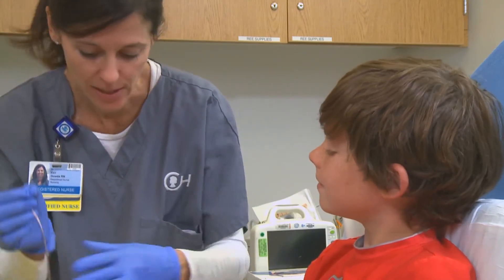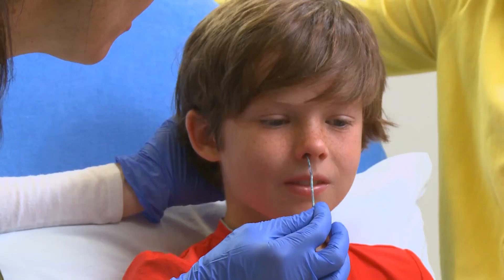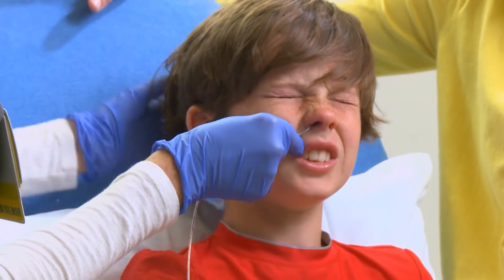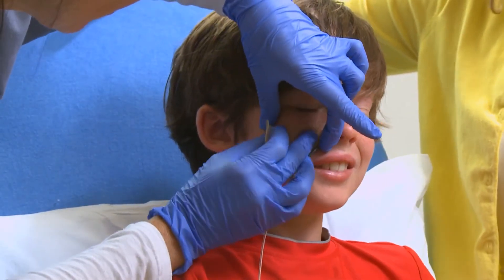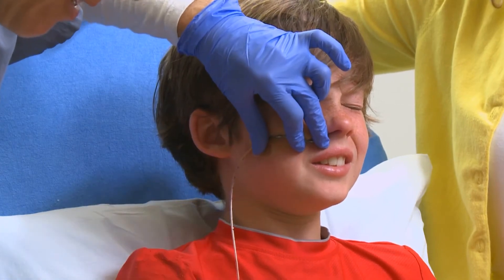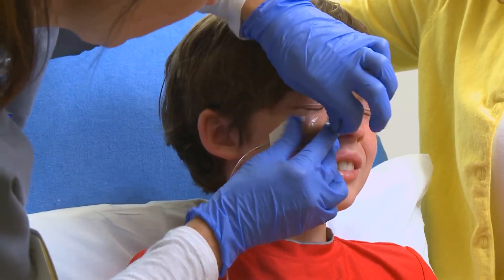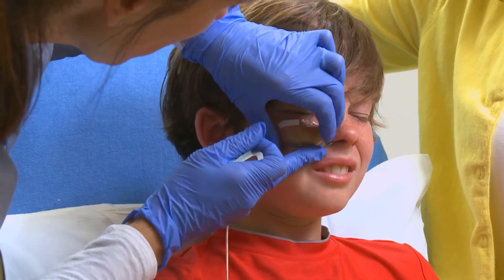You ready? When I tell you to, I want you to swallow, because your swallowing helps the probe go down. Ready? Swallow. Swallow. Great job — we got it where we want it to be. I'm going to put the special tape on it, and you can hold onto my hand if you'd like to. Perfect, this will help keep it in place. Sometimes you do sneeze once it's in, but you'll get used to it, I promise.